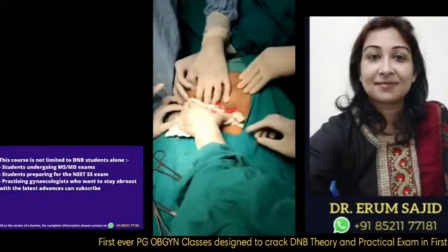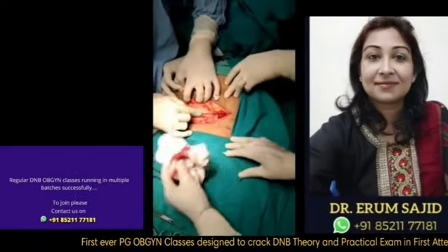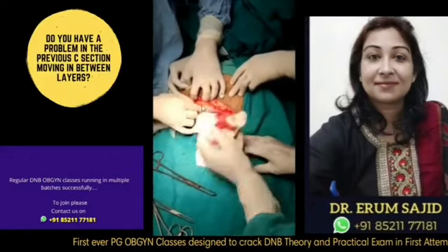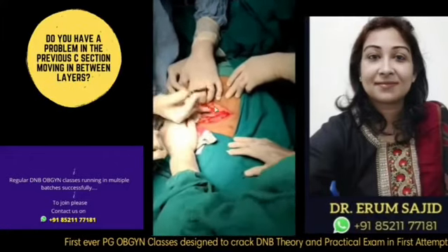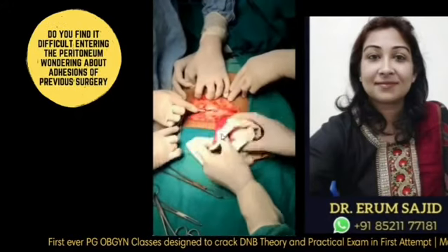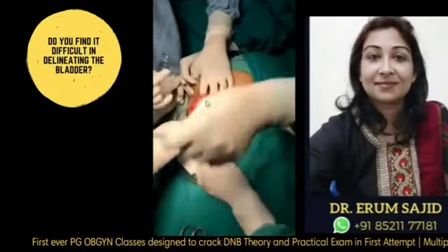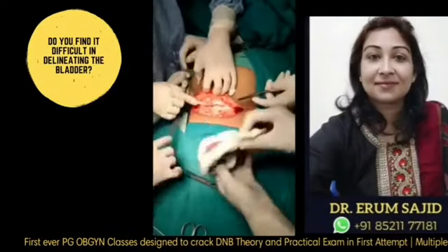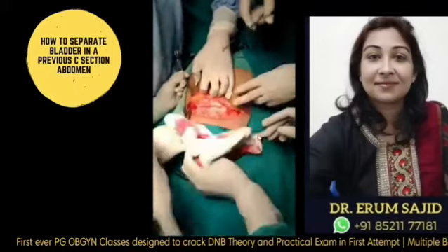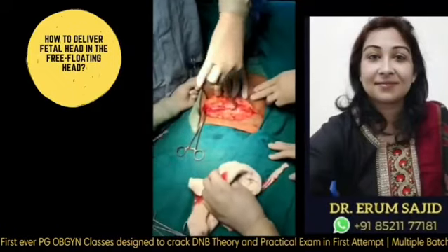Once I have stabilized and stretched the skin, I usually do it with my own hand; I don't ask the assistant to do it. Here you can see the subcutaneous fat and the subcutaneous fascia. This white structure is the rectus sheath. See, I'm asking her to press on it, and the rectus sheath is highly fibrosed. Now my assistant can be seen holding the rectus sheath.